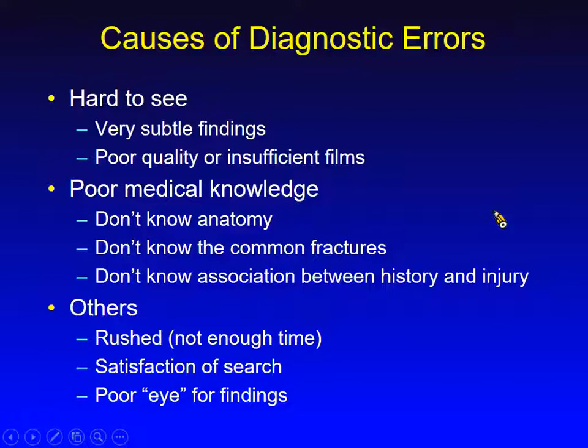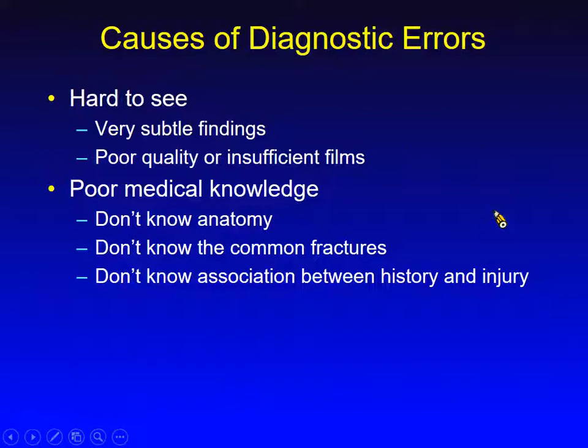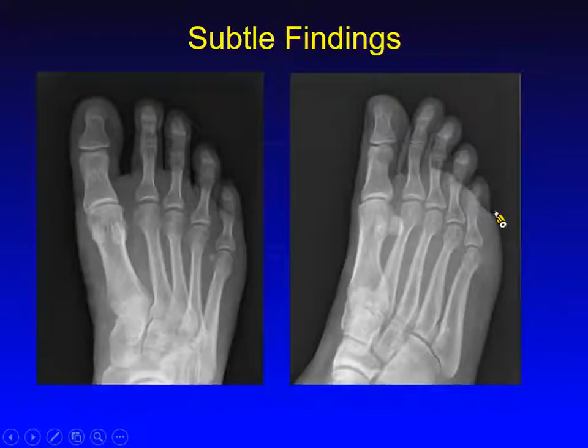And other things would be like you're rushed. And I think we're all very rushed in terms of our day-to-day practice, but obviously you need to set enough time that you can actually look at all the images and make your diagnosis. Satisfaction of search can affect whether or not you make a diagnostic error. And also you may just have a poor eye for the findings. So we're really going to talk about the top two, because the other ones are kind of hard to teach or give tips for.